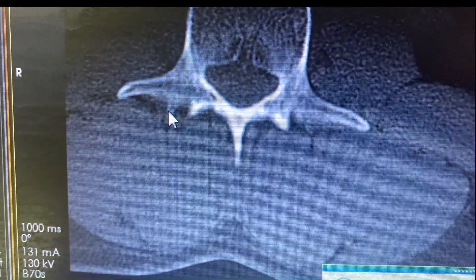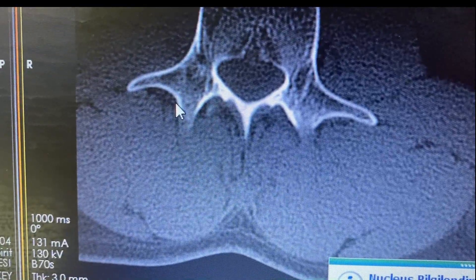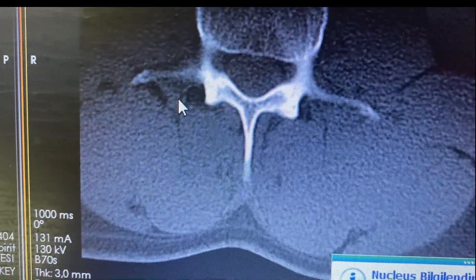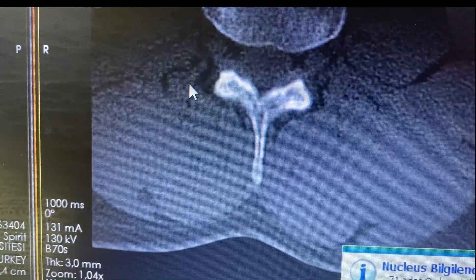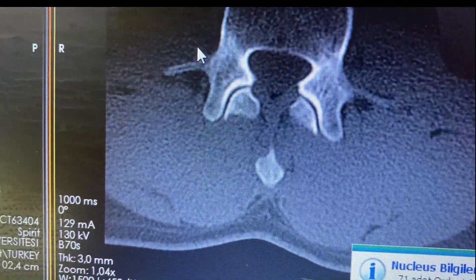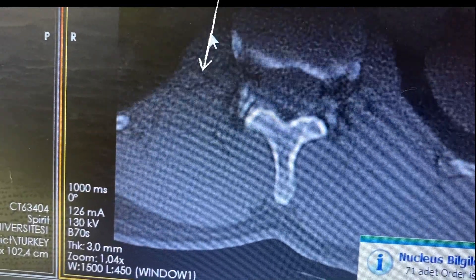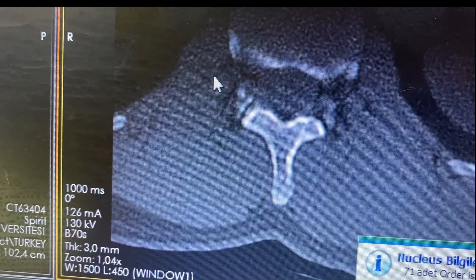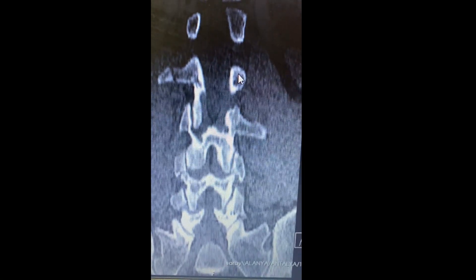This patient fell down from the stairs and had bilateral vertebral transverse process fractures. He had ongoing low back pain and was admitted to my polyclinic.